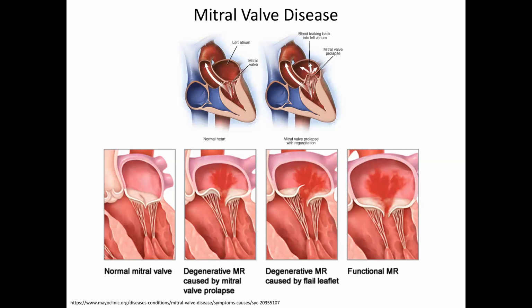Then you stick that in the heart chamber and you just look around, right? And you rotate the probe. So that's intracardiac echocardiography, and that's often used while you're doing this type of interventional procedure. So that's getting from one atrium to the other.